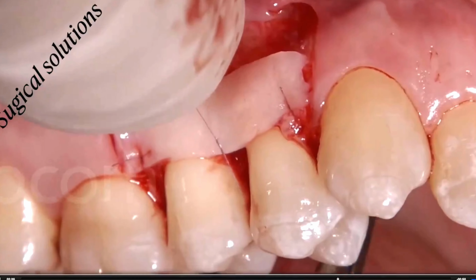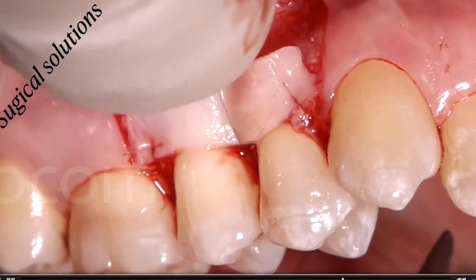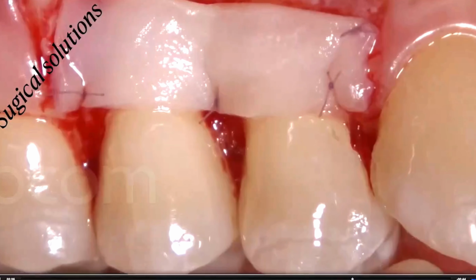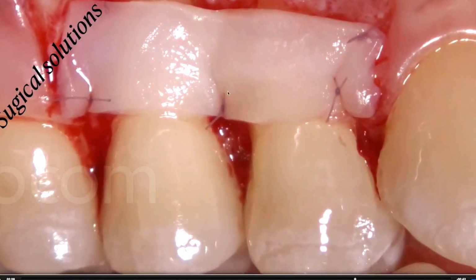And obviously, you have to block the graft at the base of this papilla by fixing the surgical knot onto the graft. And you see that despite the graft being very nicely applied to the root, there is still the vascular bed of the entire anatomic disepithelialized papilla that is available for the surgical papilla of the flap.